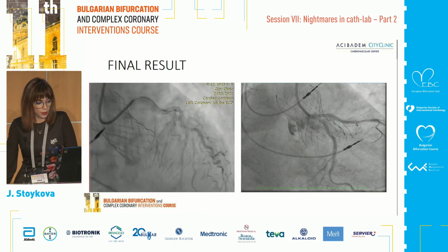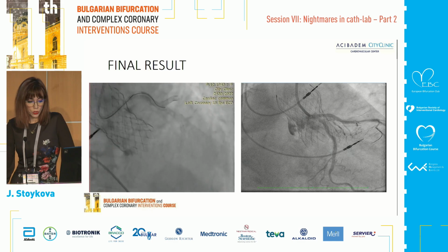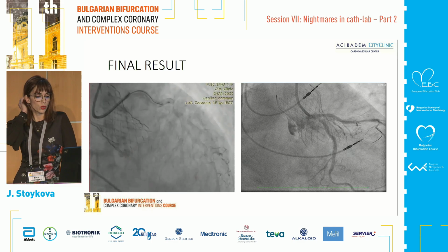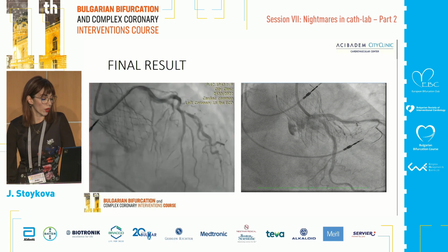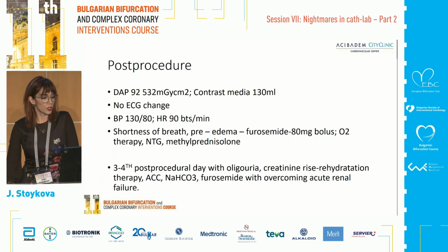So this is the final result of the mid-LAD, and we did a kissing, of course, of the ostium of the circ and the ostium of the LAD with non-compliant balloons. This is the final result of our patient.